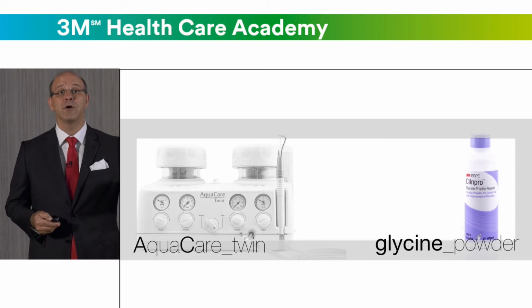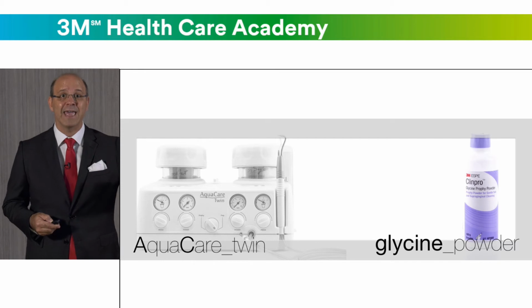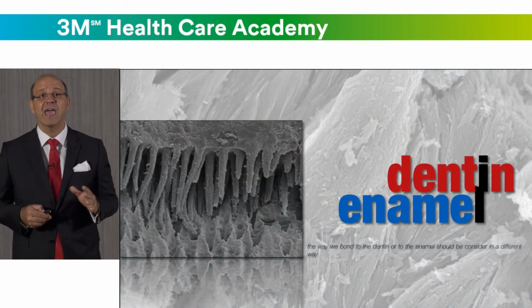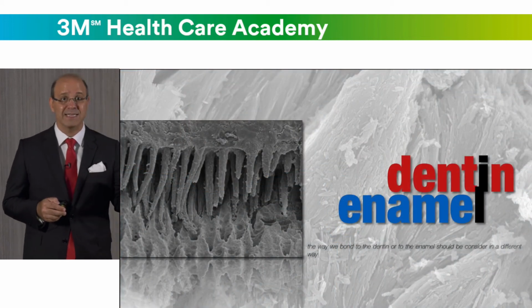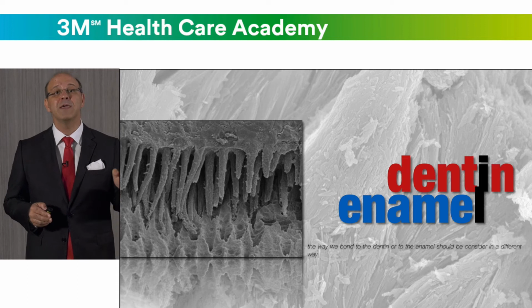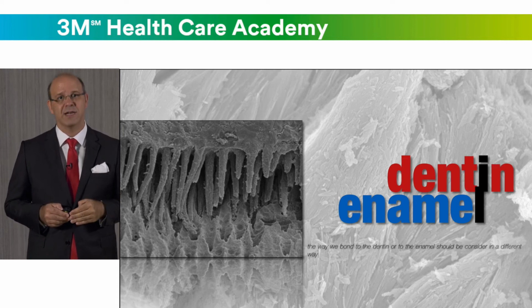Then you can go on and achieve a good bond, and also a good application of composite resin. When we apply the adhesive, we always have two tissues, the dentin and the enamel, but they are totally different. The enamel is more micromechanical retention, while dentin is more chemical adhesion.